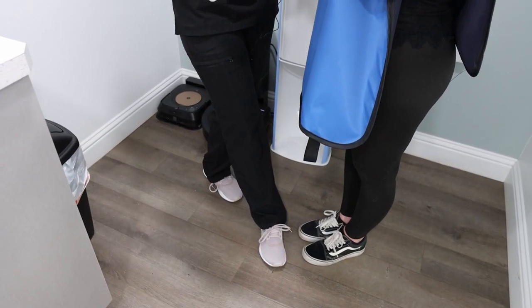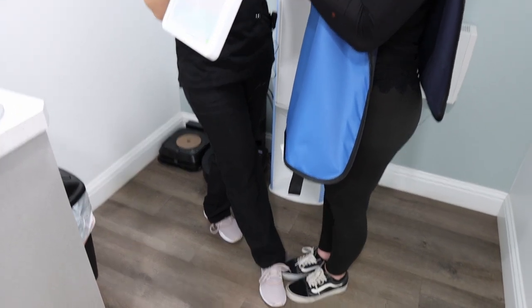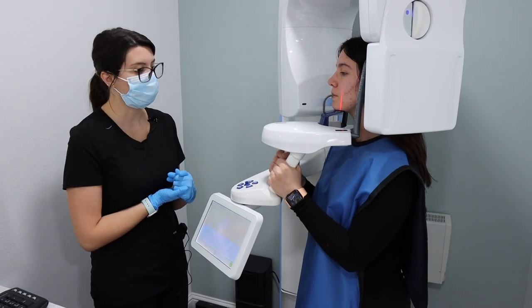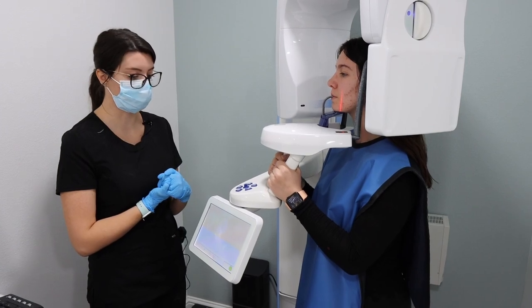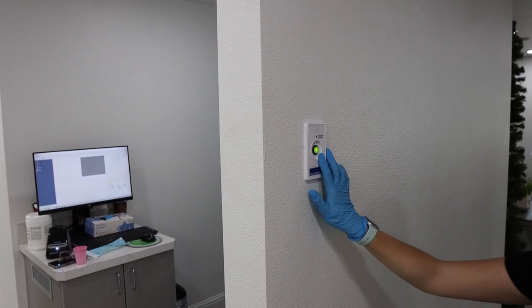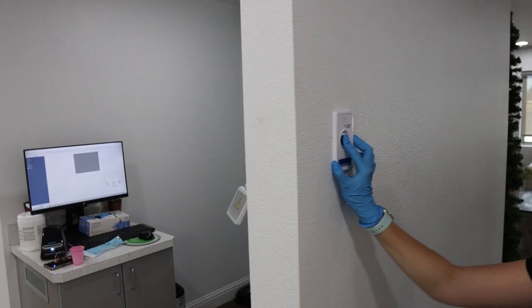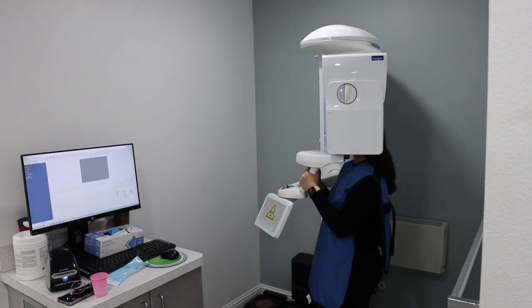You want to wait for the button to turn a solid green color. Then you're going to press and hold the button, and you do not want to remove your finger until you no longer hear the noise from the pano machine.